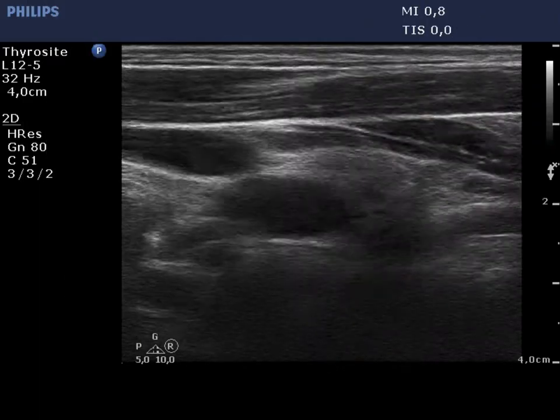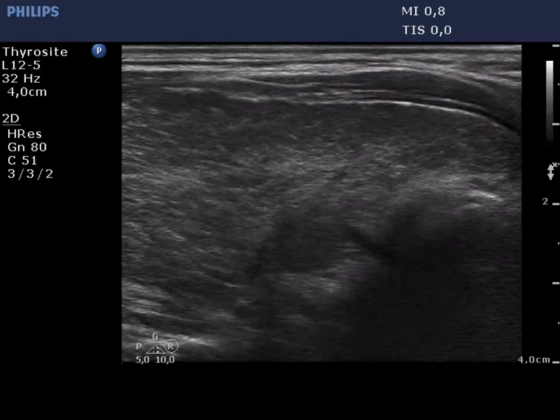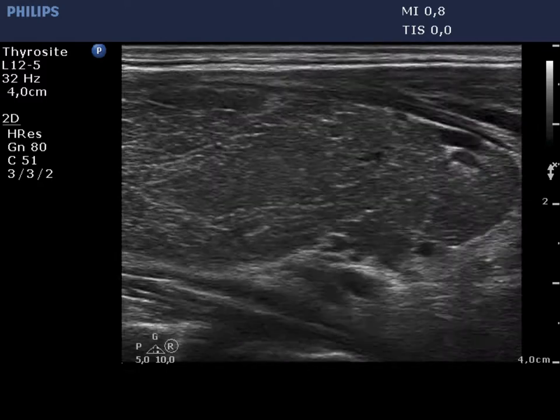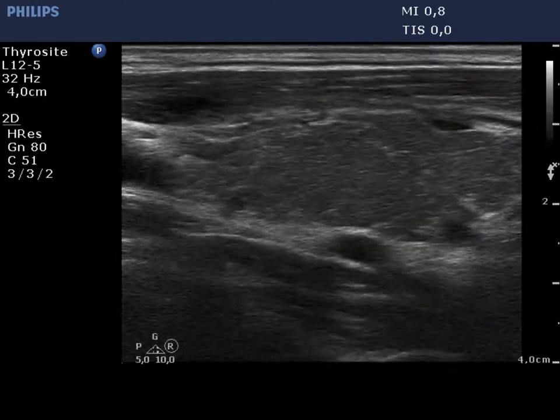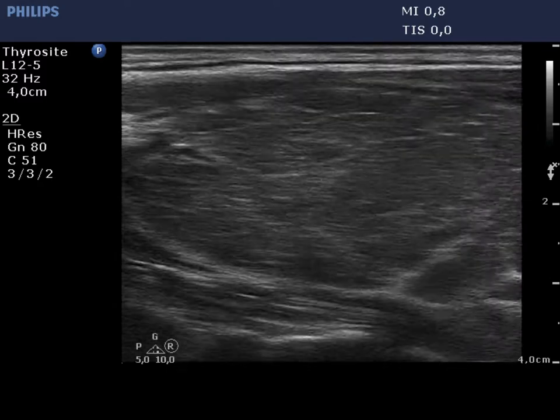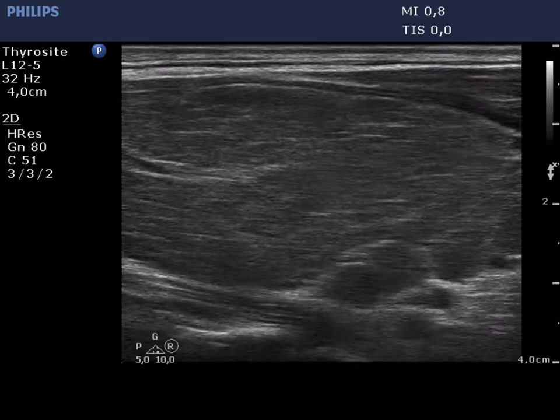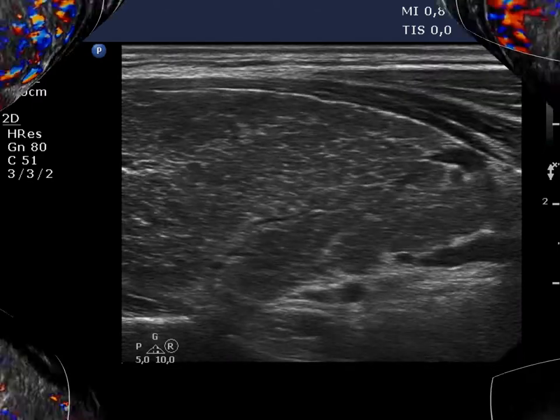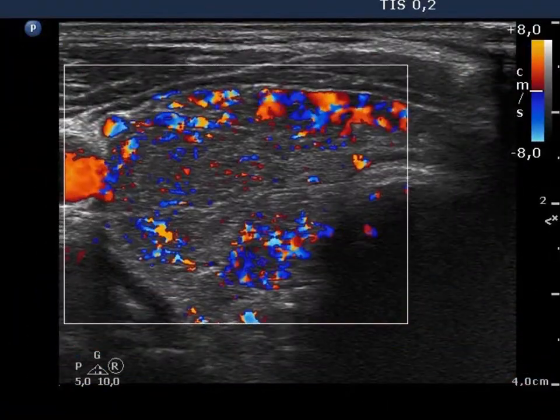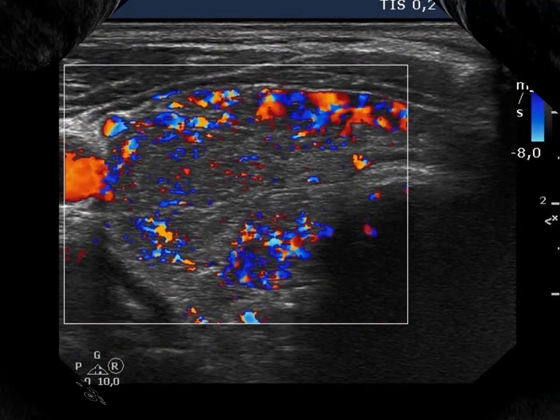The right lobe is hypoechoic and enlarged. Note the presence of connective tissue. The vascularization is significantly increased.